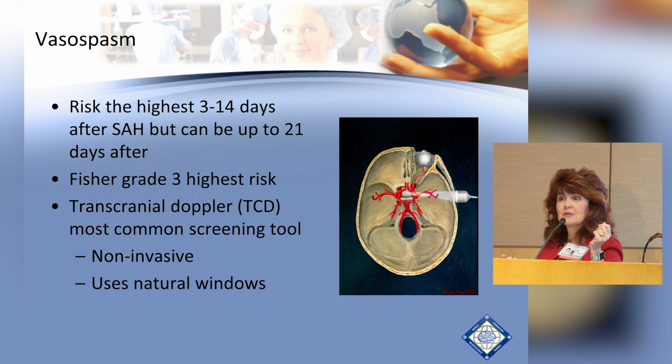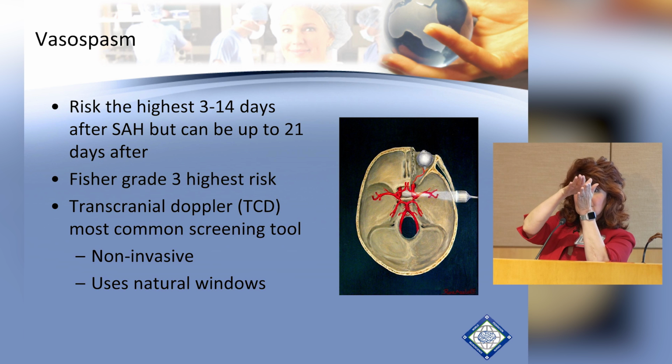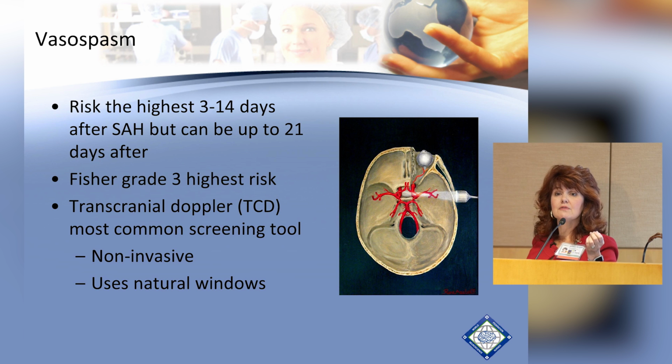You also see at our hospital, our nurse practitioners, Joan or Lori or one of the others that's trained to do transcranial Doppler. It's a great screening tool. It's non-invasive and it uses natural windows, usually the temporal bone, which is thin, and you're able to look into the brain and look at the velocities of the vessels. If the velocities are very high, you expect that vessel is very narrow because you're running a lot of blood through a very, very tight pipe. And so that's what we're looking for. It's a screening tool. And once we see that, sometimes they'll send them down for CTA and/or angio to confirm that and then decide whether or not they want to give them medication intra-arterially to try to open up the vessel.